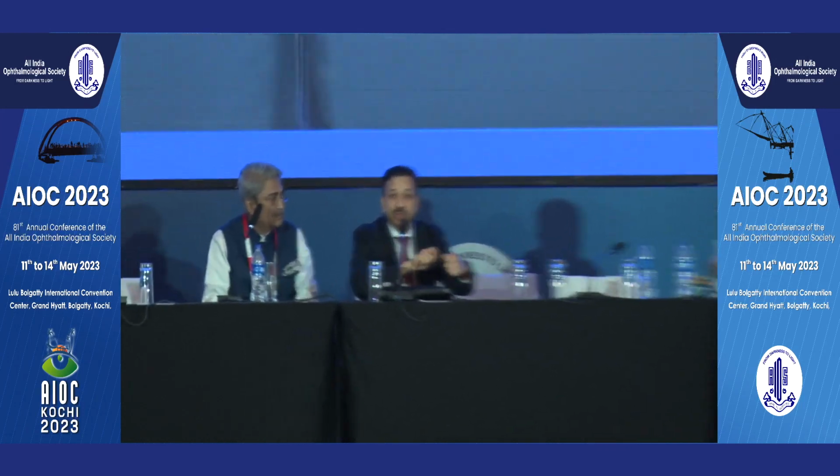So what you will see in his videos and my videos, we never use a two-handed technique. We are not fixing the sclera when we are doing the peeling, because when you do that, you will not be able to assess the resistance. So that's why the tissue is lying in the endothelial punch block, and you are using one hand to peel without providing any counter traction. So the moment you encounter a resistance, you can see movement of the corneoscleral rim, and you know that there are abnormal adhesions. So I think that's very important to see.